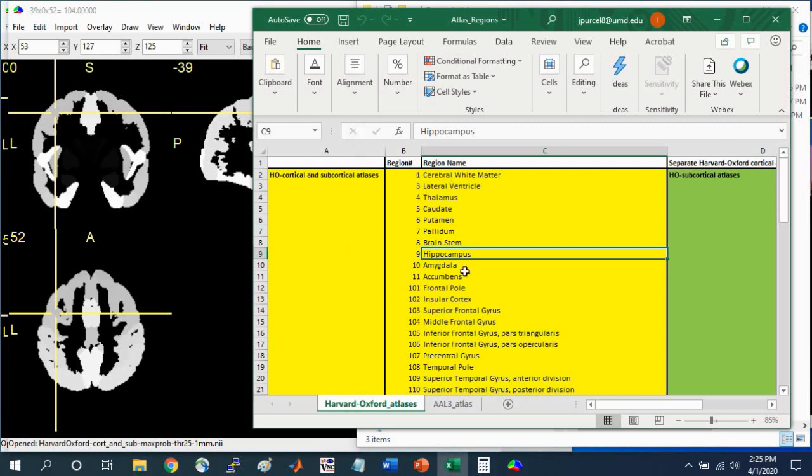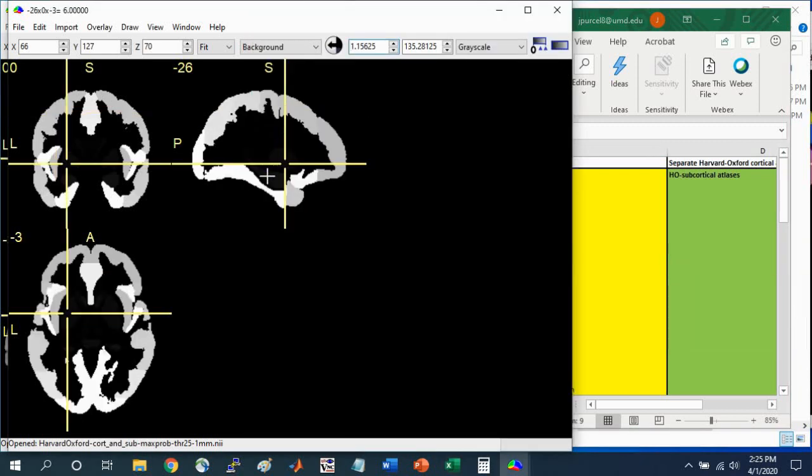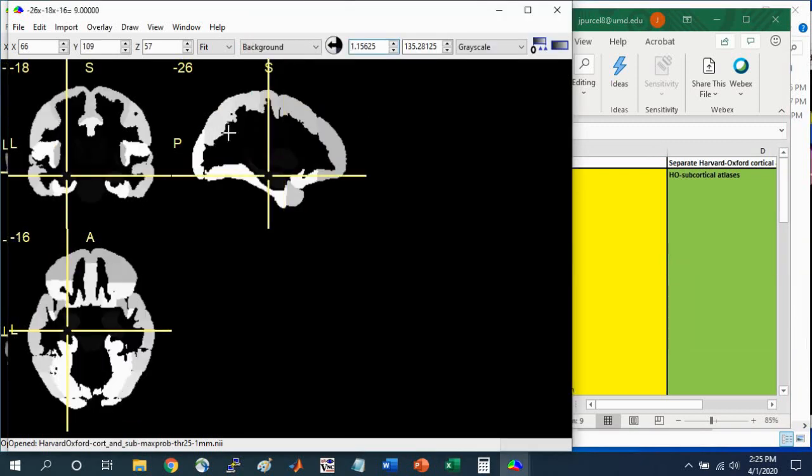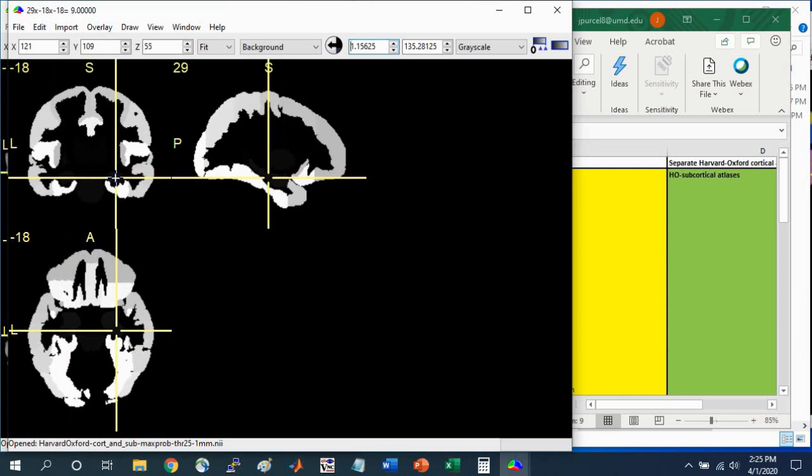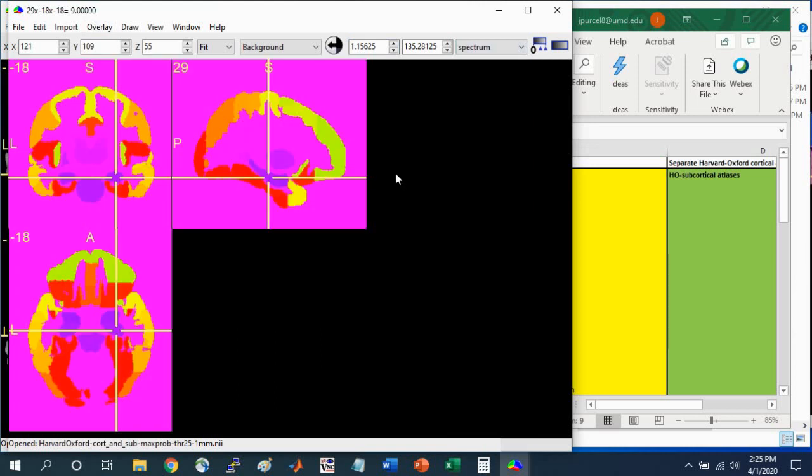I've listed the names associated with each of these numbers. Region 9 is the hippocampus. You can navigate to the hippocampus here. You can see that it's 9 on the right and left hemisphere. If you want to see these colors a little more clearly, you can change the scale to spectrum. Now you can see them more clearly.